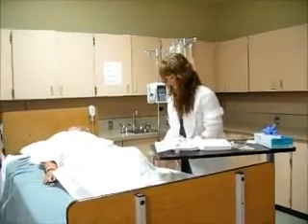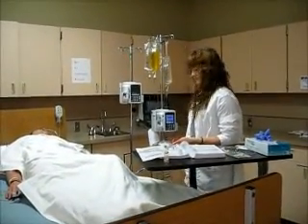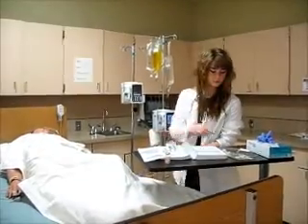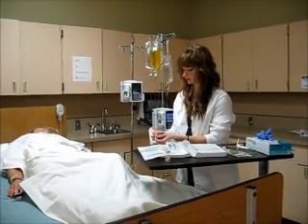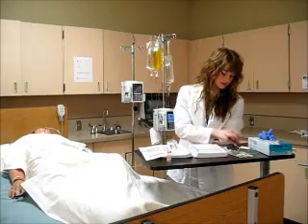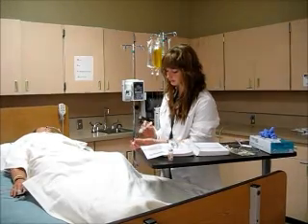Alright, so I know that I have fluids running through here, so I know that the IV is patent. I've looked at it. So I'm going to give my bolus. I'm going to take an alcohol swab, and I'm going to clean off my port. While I'm at it, I can just clean this off too. And I'm going to do that for 15 seconds. I'm going to make sure that I don't let this touch anything so it remains sterile. And I take off.